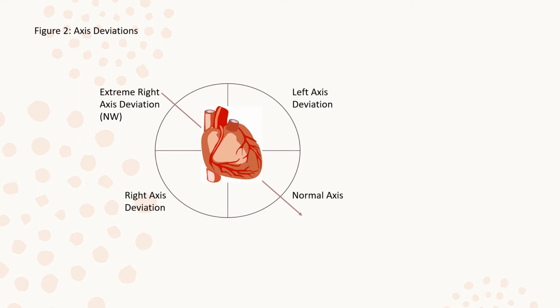The heart gets bigger, right? In older people, the heart gets bigger. A lot of people have heart failure. And so it tends to shift left. And so the energy is now traveling more leftwards than it is towards this 90 degrees of the normal axis. Okay.